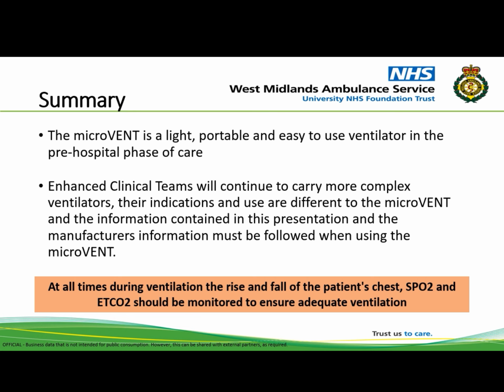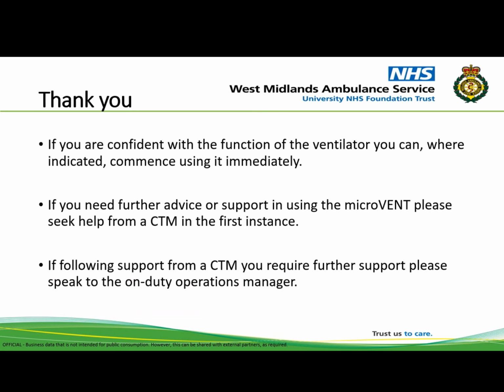Thanks again for listening. If you are confident with the function of the ventilator after you've watched this presentation and read the clinical guidelines and manufacturer's instructions, you can commence using it immediately. If you need further advice or support in using the MicroVent, then please contact your CTM in the first instance. If, following support from the CTM, you require further support, please speak to the Duty Operations Manager on duty.